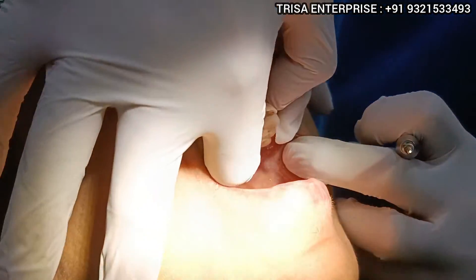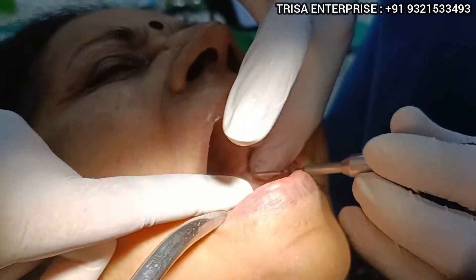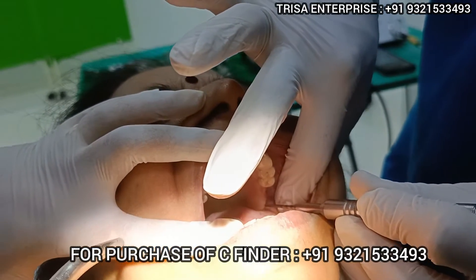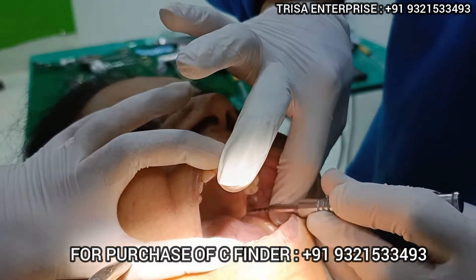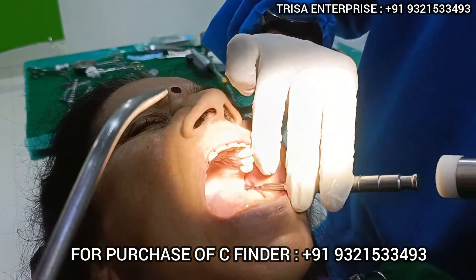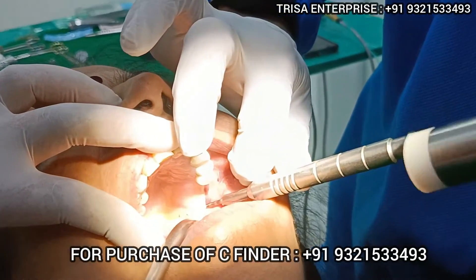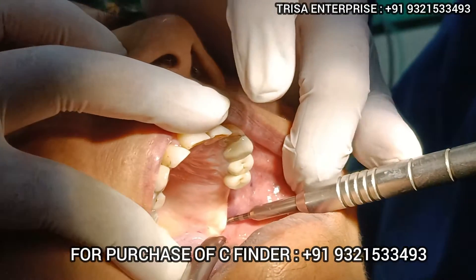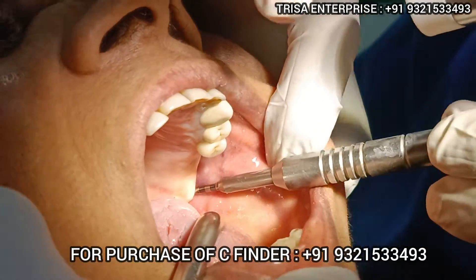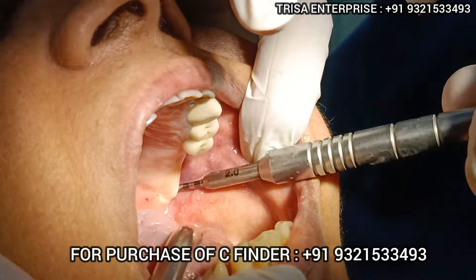I am starting with the pterygoid implant. As usual, I will palpate the hamular process. This is the tuberosity area — I palpate the hamular process and go towards it with gentle malleting. This is my probe; I am getting good resistance here. This is my probable direction for the implant. Now I will use my first drill, which is my pilot drill.